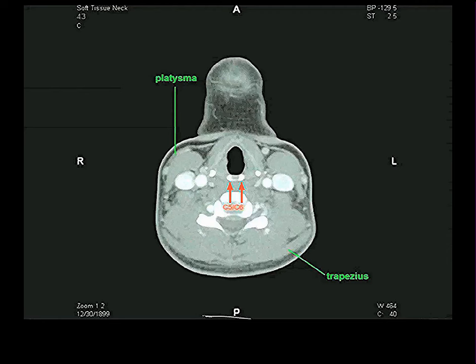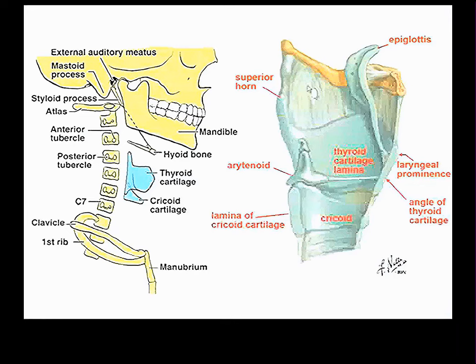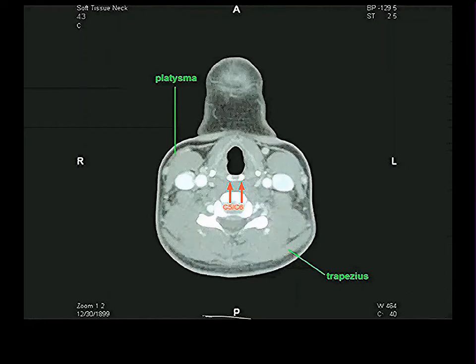The arytenoid cartilage. Look at the arytenoids. They have this sort of peak there. They have this part which extends forward, which attaches the vocal fold, a part which extends backwards and laterally, which attaches to muscles, and then this thing which just rises high, like a peak. And I'll bet you that that's what we're looking at, a calcified peak of the arytenoid cartilage. Never thought about it, but I could not even begin to think of anything else it could be, to be honest with you. All right.